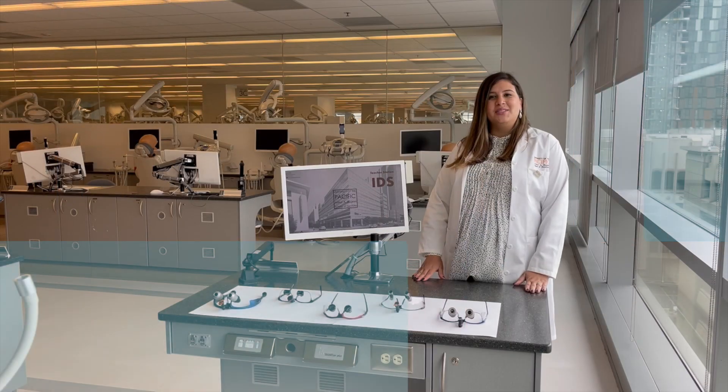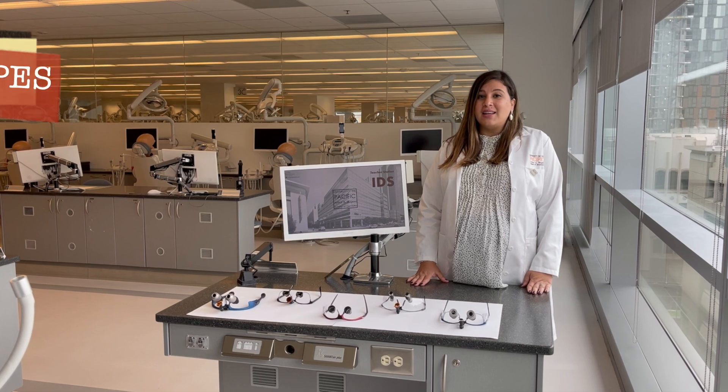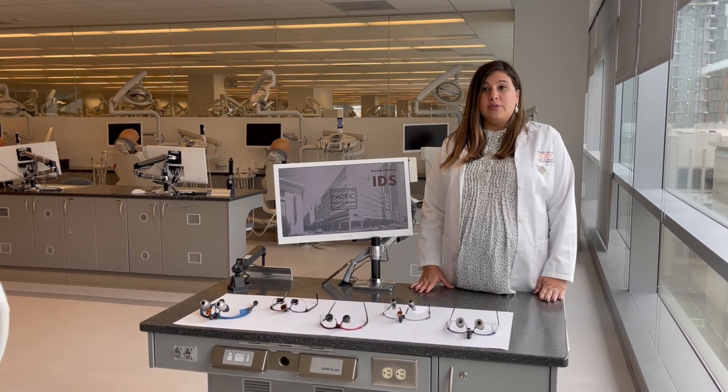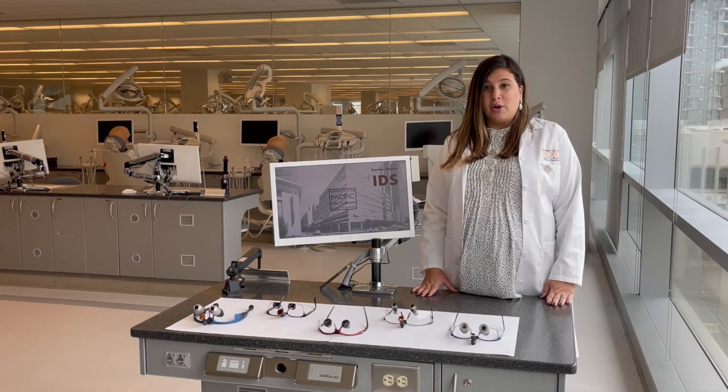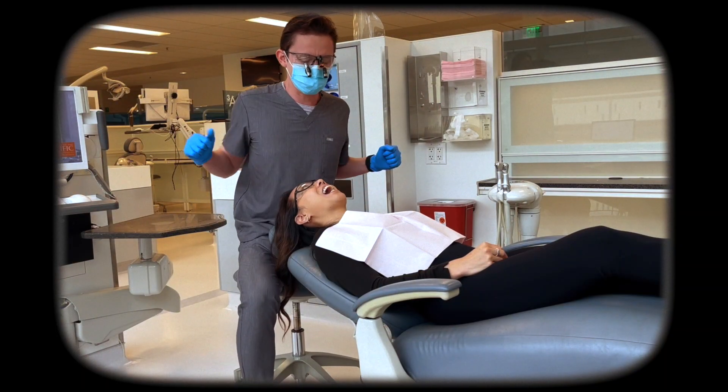Hi there, new dental students. We're here to welcome you to the world of dental loops — you know, those funny-looking glasses dentists wear. Loops can be very helpful with better visualization and improvement of posture with the correct working distance and magnification. We have some information that will help you choose your perfect pair of loops.